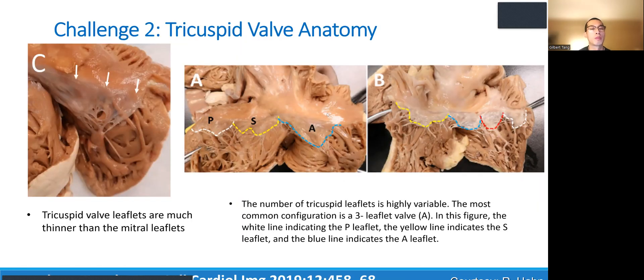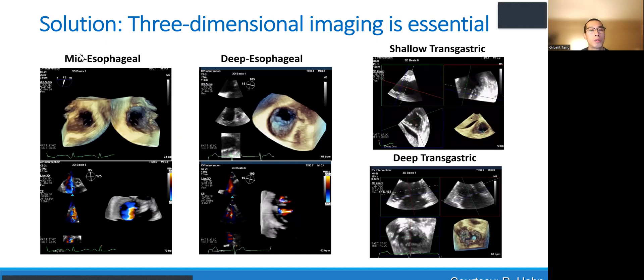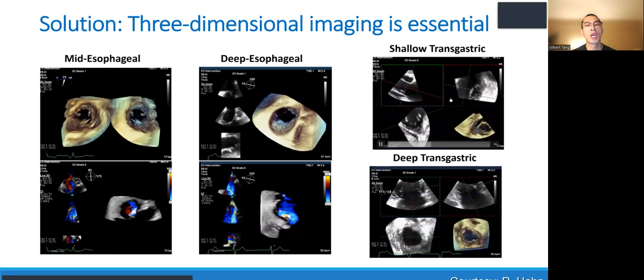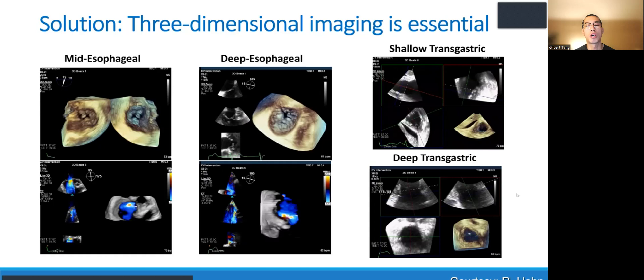Another challenge of tricuspid anatomy is that there are often scallops or deep indentations that look like more than one segment or leaflet. On the left side it looks like three clearly demarcated leaflets, but you may see multiple scallops — actually four or even five segments of leaflets. So you need three-dimensional imaging, using the mid-esophageal, deep esophageal, and shallow transgastric views to really determine how many leaflets are present on the tricuspid.